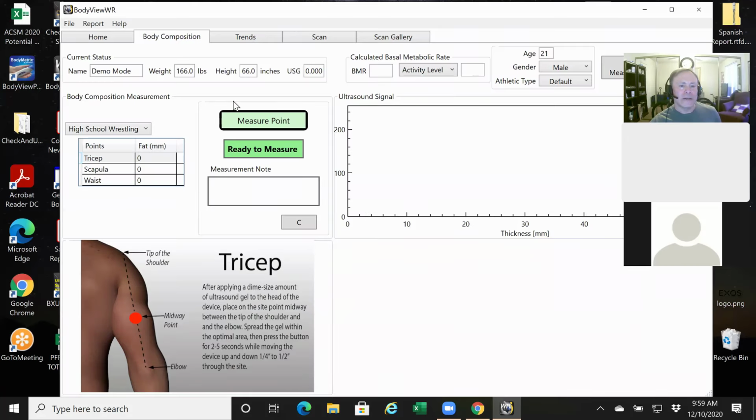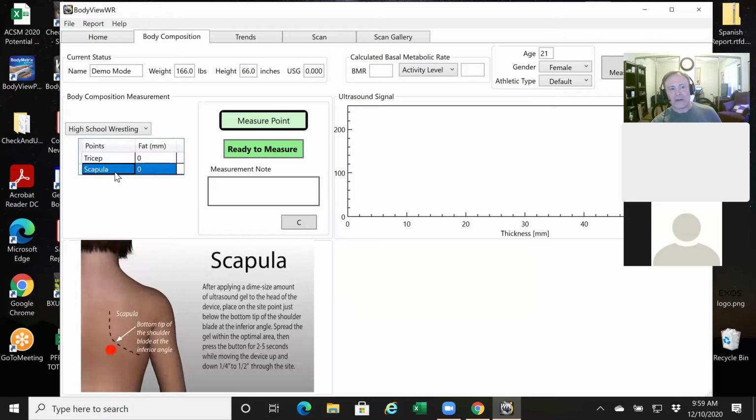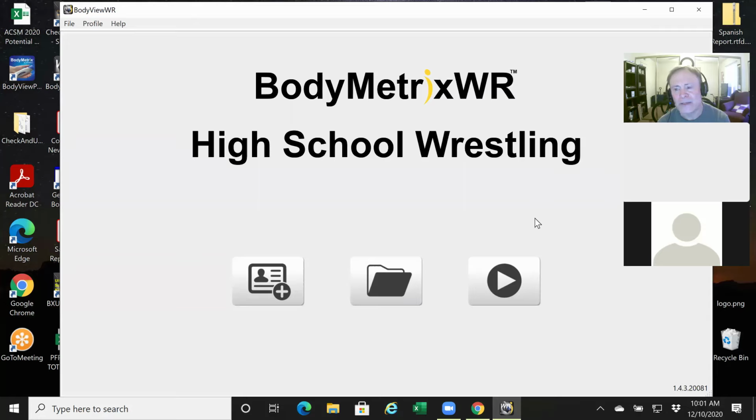The only thing I didn't discuss is females. Are you going to have female wrestlers? I honestly am not sure if we have any. Okay. So the only difference with females, the technique, everything is the same, but we're only measuring two sites. I'm sure you probably already knew that. Pretty simple. I think just practicing with it a little bit and using good technique, plus the analysis of the graphs that we talked about, you should be good.